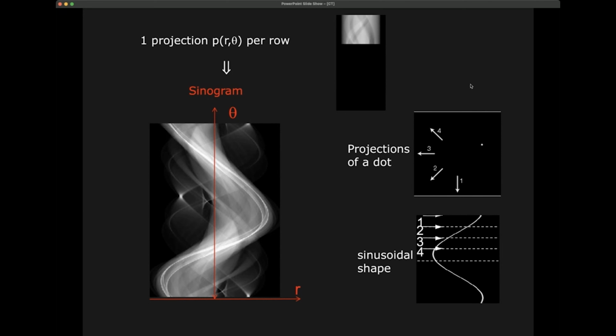Now, if we start moving the X-ray source around this object, with regard to the center of our detector and the center of our X-ray source, by the fact that this dot was at an asymmetric position, it becomes more and more to the middle. So if our X-ray source would be here and the detector here, this projection would fall exactly in the middle of the detector.